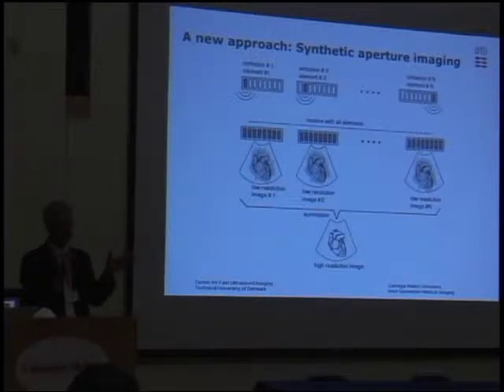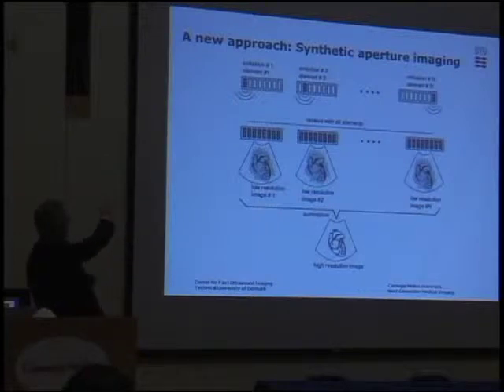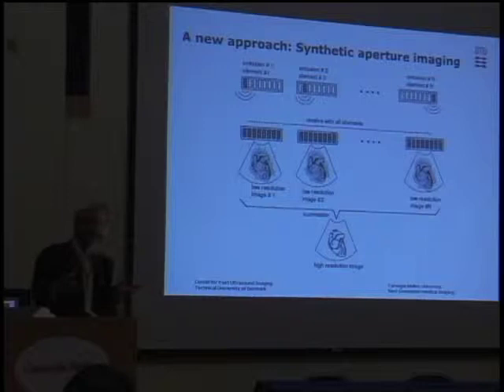from one shot. And then we go over the apertures as I've shown you on top, and then we acquire with one image, at the whole aperture, but send out with a part of it. And when we've collected all of that data, we can actually make an image which is perfectly focused in both transmit and receive, because we have the full data set.